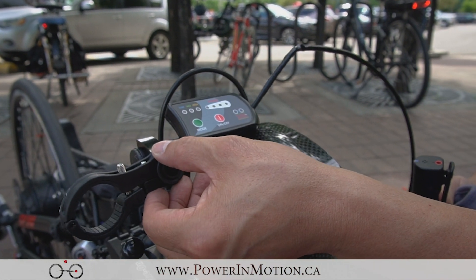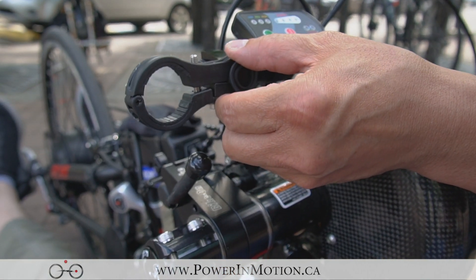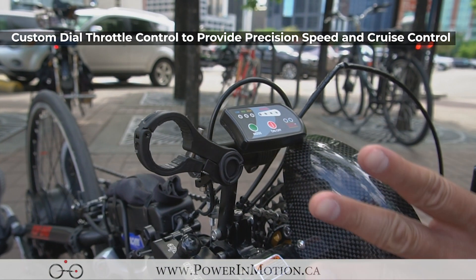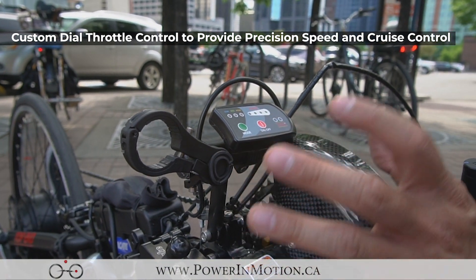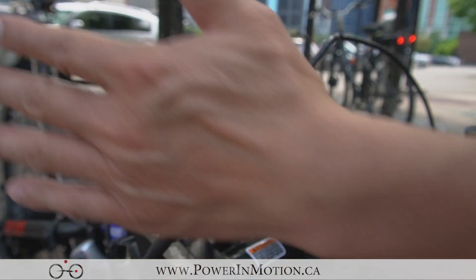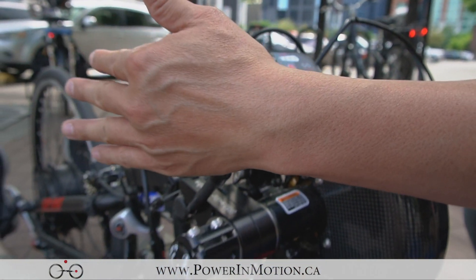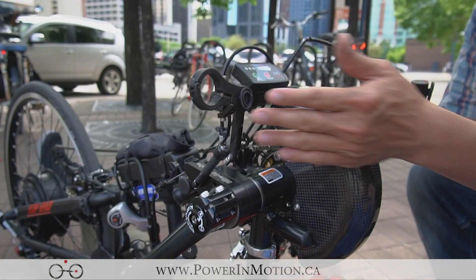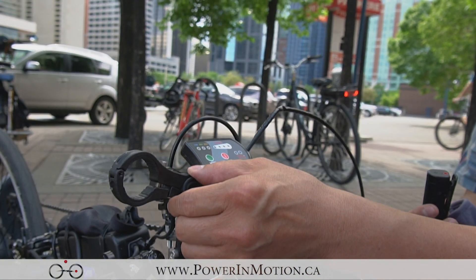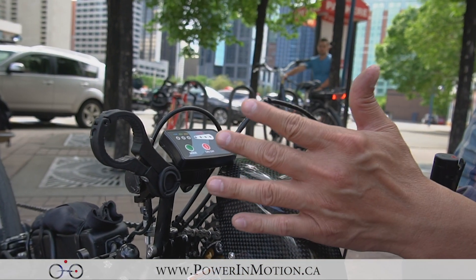One very interesting thing we've modified is having this special throttle, and we mounted a particular bracket on it. When Ian wants to speed up, all he has to do is turn it. The nice thing is he doesn't really need to use his full hand — he can use his finger or his palm to move the throttle. When he dials it, it locks the speed exactly at how much speed he wanted, so he can continue to add more hand power to the hand cycle.